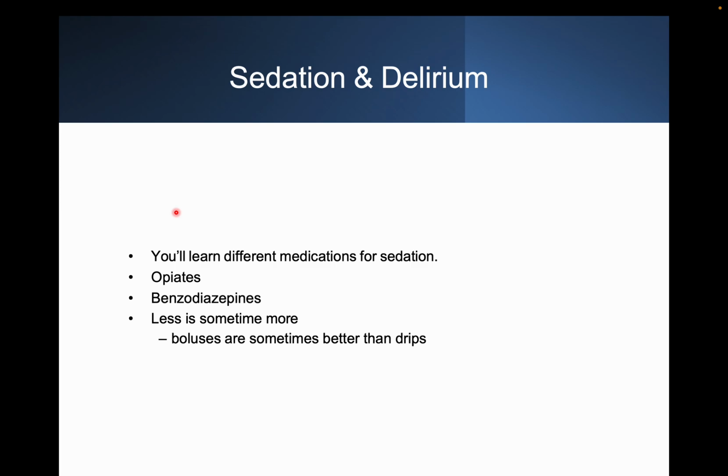Then the next thing is you need to sedate the patient. If the patient is in ARDS, for example, he will obviously be tachypneic. If you put him on a ventilator, the tachypnea will continue, but whatever breathing he is taking is not generating enough minute ventilation because tidal volumes are low. So the patient goes into respiratory fatigue, which will worsen the condition more. So it is better to sedate those patients.